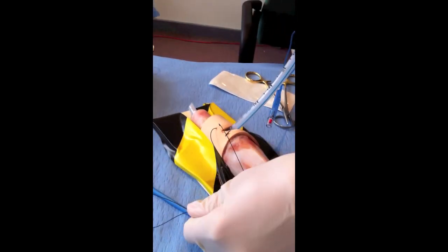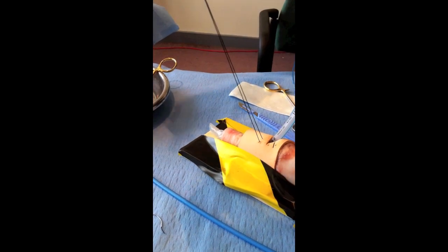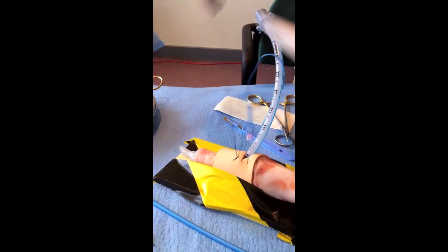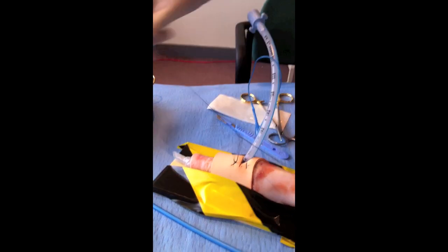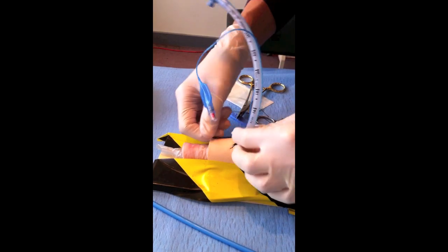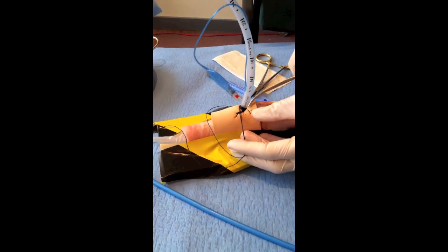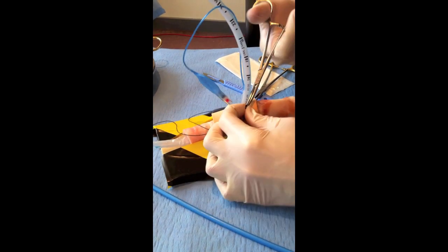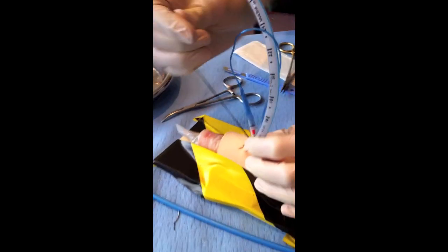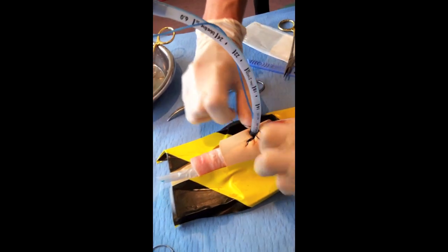I want these two to be about equal in length. I pull that tight, and I'll now rid myself of my sharp. Let's get them equal in length. Now I do a surgical knot, nice and tight to the skin. Once I've secured that, I now pull that tightly around the tube, in the same way as you would do with a chest drain, at the level that you want it — really pull that tight. Then taking the same curved forceps, I just pull that suture through there. So now it's anchored at two points to the skin — anchored by that knot, and anchored by virtually pulling it through that loop. Then split the two and do a nice tight surgical knot again there.